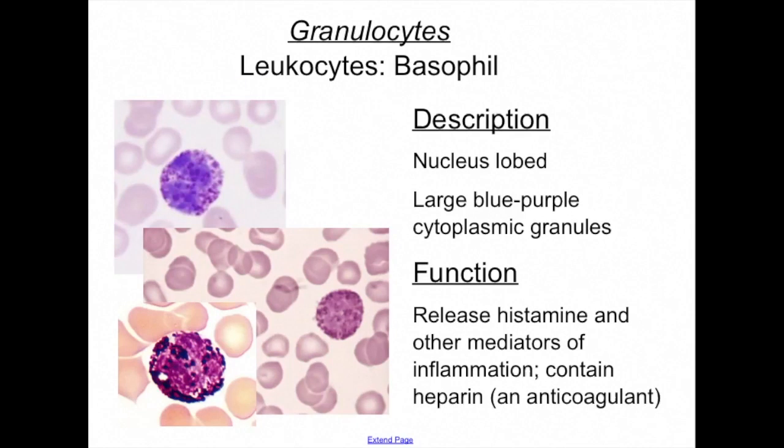The next granulocyte is the basophil. Some people like to call this the big bad basophil because it's almost twice as large. Basophils are the rarest white blood cells and only average about 0.5 to 1% of the leukocyte population. Their cytoplasm contains large coarse histamine-containing granules and have affinity for the basic dyes, so basophil, base-loving, and the stain is purplish-black. The histamine is an inflammatory chemical that acts as a vasodilator, which makes the blood vessels dilate and attracts other white blood cells to the inflamed site.